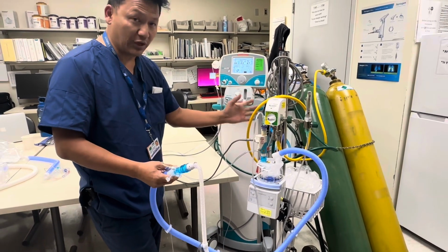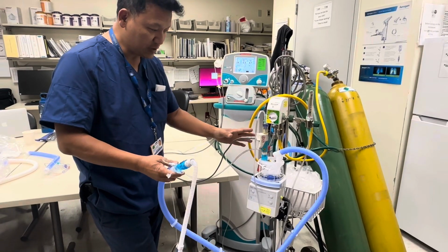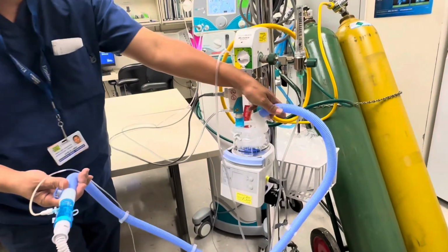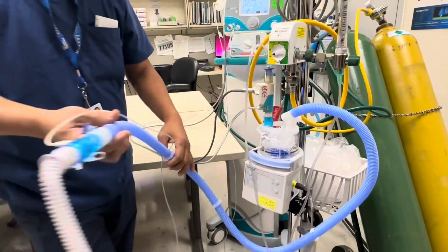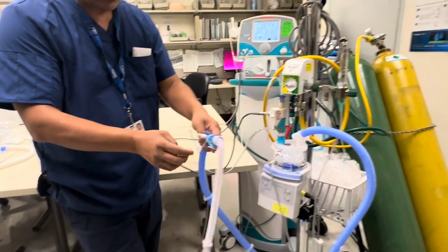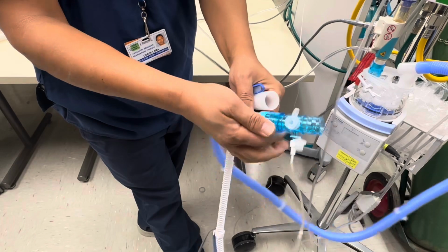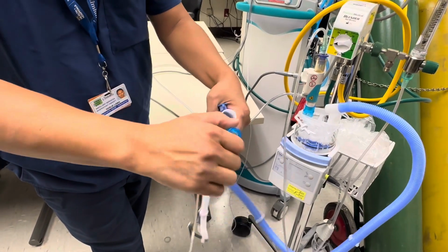So this is a regular blender for the HiFlow and the blender. You need that. And then the way we did this here is this is a ventilator circuit, okay? One port goes here with the heater wire connector. And then the other side, just the blue one, okay? And the white one you disregard. Only the blue one. The other end of the blue one, we just need 2 connectors, okay? This is the MDI connector. We have it here in Raymond's room, in our supply room. So you just need this connector here.